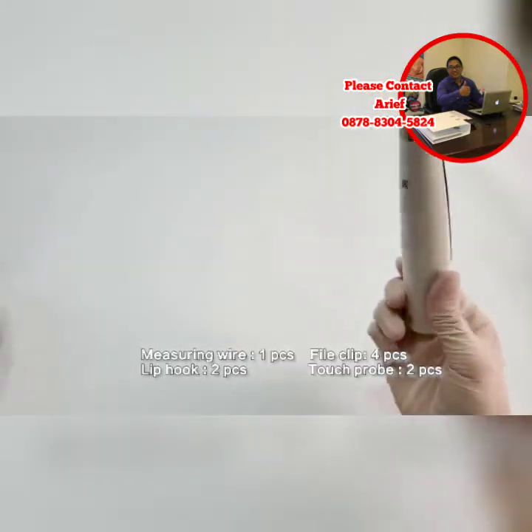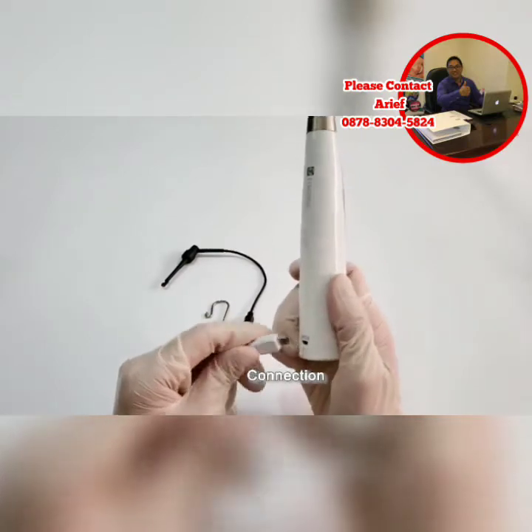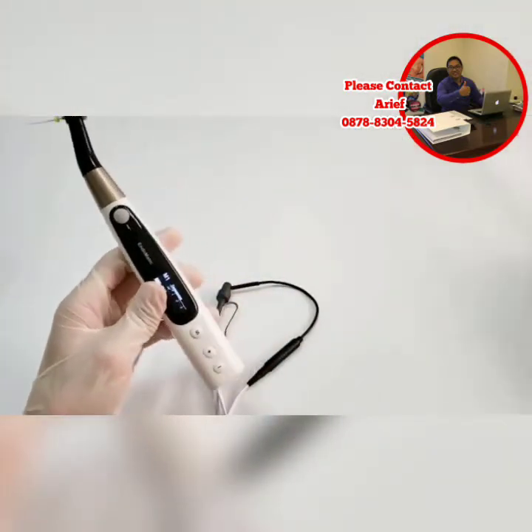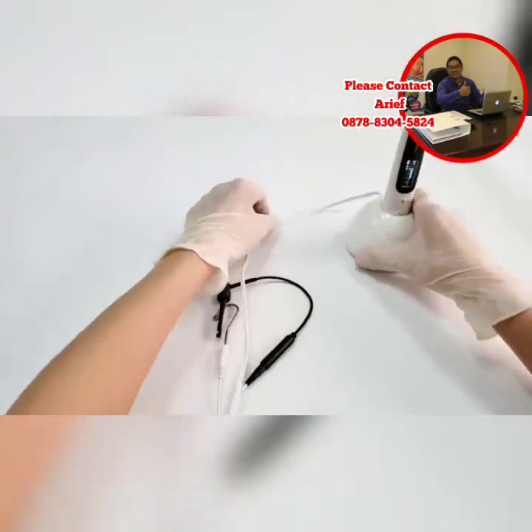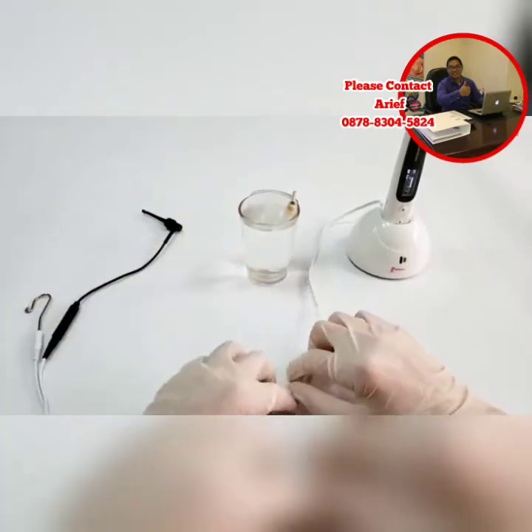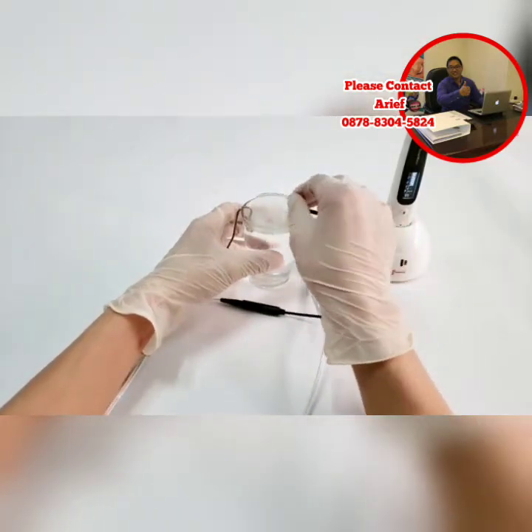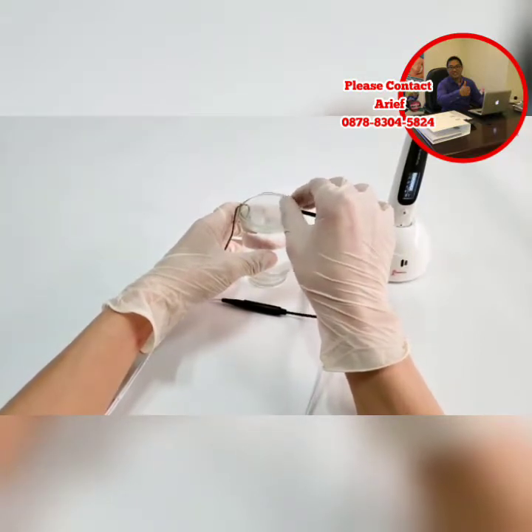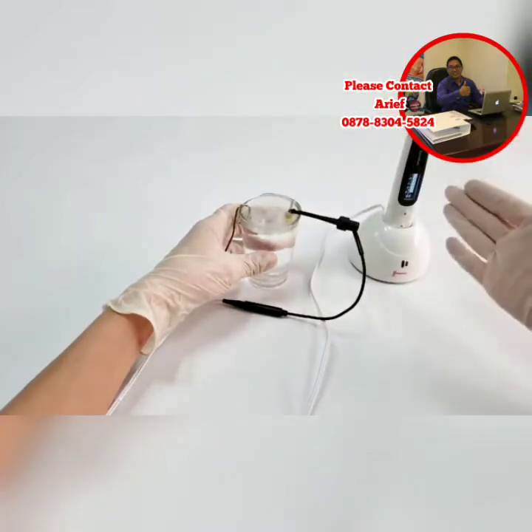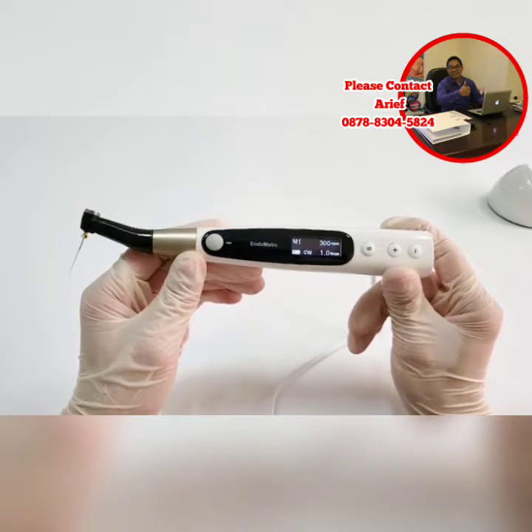This device is equipped with a measuring wire, file clip, and lip hook for measuring length. Connect the measuring wire with the main unit, then connect the measuring wire with the file clip and lip hook. Put the main unit on the charger base. Here is a simulator for demonstration. Hold the file with the file clip, then slowly move into the deep root canal. When the file reaches the apical foramen, the device will emit a continuous sound. Preparation with measuring together is also available — the position of the file tip inside the canal is shown on the display automatically during preparation. This feature makes endodontic treatment safer and more efficient.